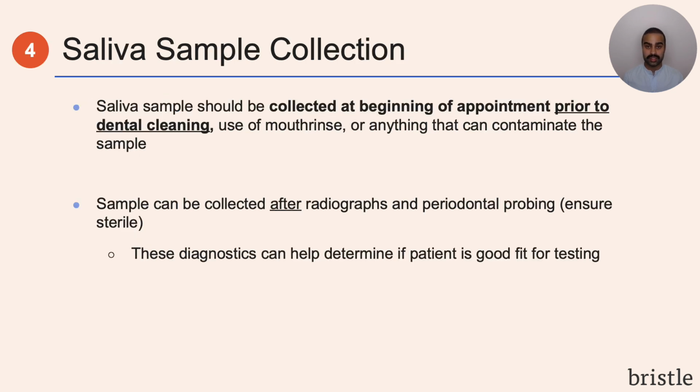Once a patient agrees to testing, the next step is to collect their saliva sample. It's very important that the saliva sample is collected before any cleaning, any use of mouth rinses, or anything else that could contaminate the saliva sample. You can collect the saliva sample after radiographs or probing if it's sterile. And many practices actually use these diagnostics up front to help determine and convey the need for testing in order to dig deeper into the root cause of these symptoms.